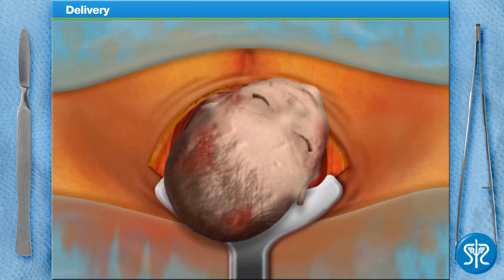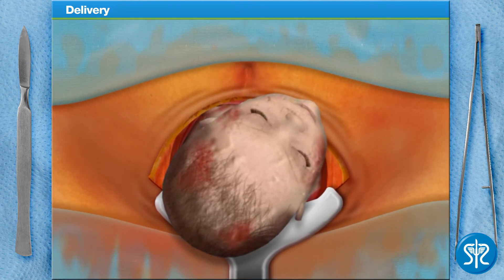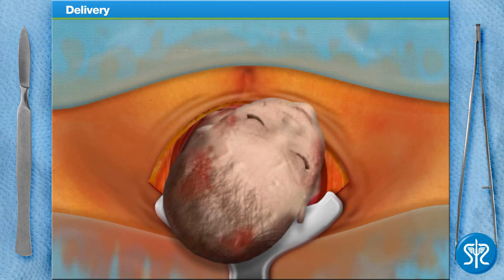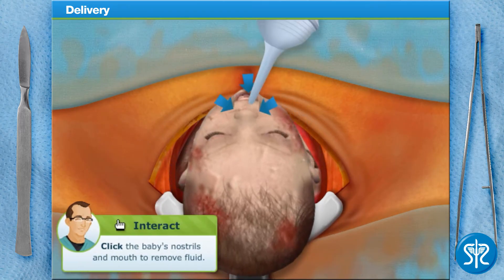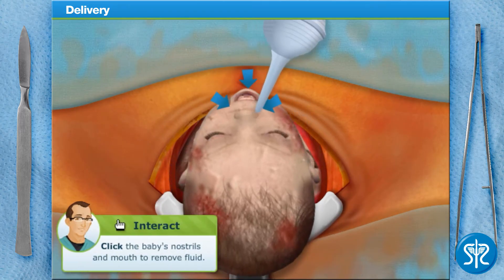Before we completely remove the baby from the uterus, use the suction bulb to suction fluids from the baby's nose and mouth.